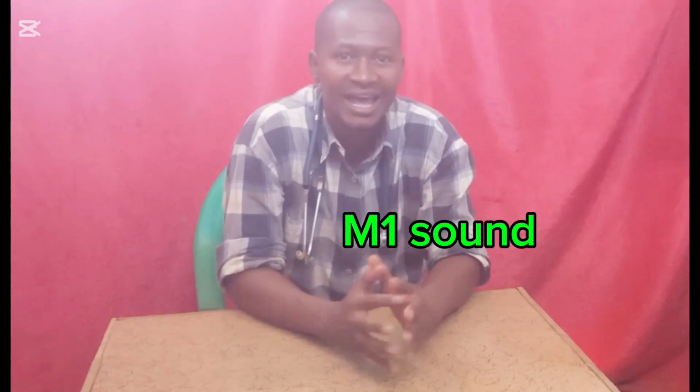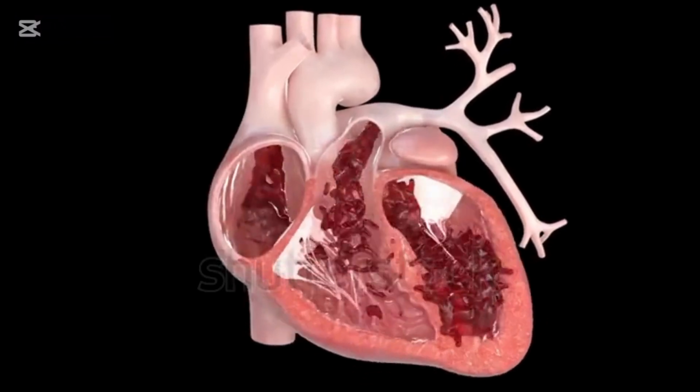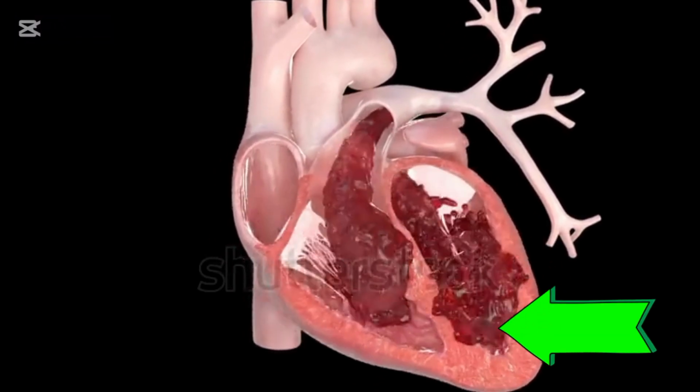The sound produced by the mitral valve is termed the M1 sound, and the sound produced by the tricuspid valve is termed T1. The M1 sound is much louder than the T1 sound due to the higher pressure inside the left side of the heart. The S2 sound corresponds to the closure of the aortic valve and the pulmonary valve.